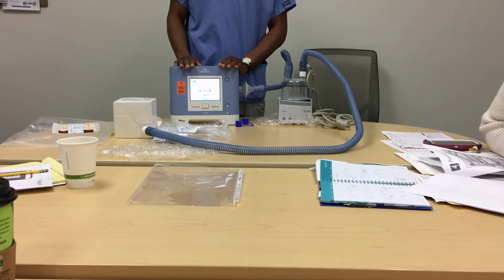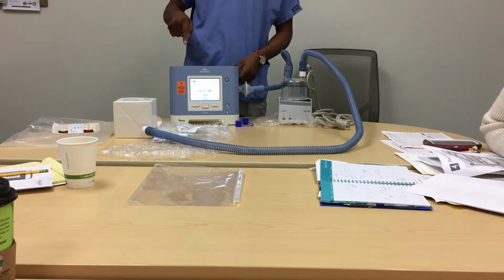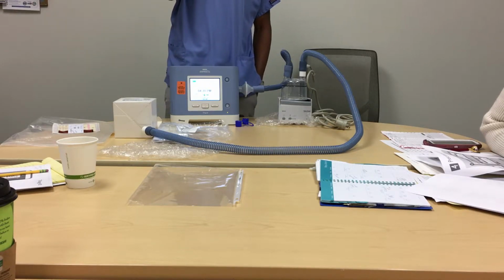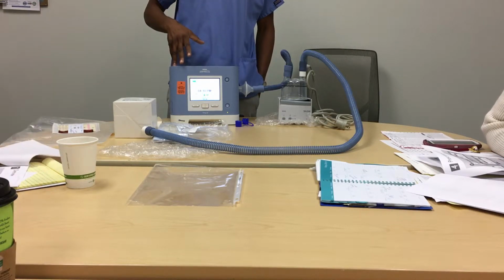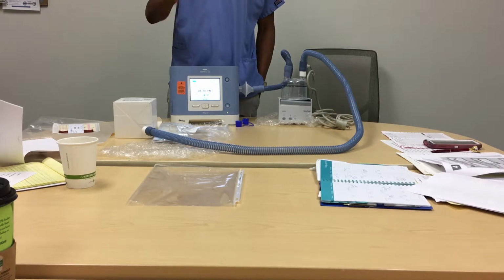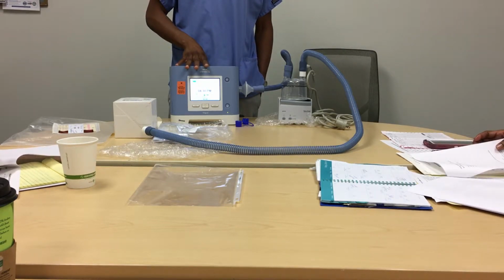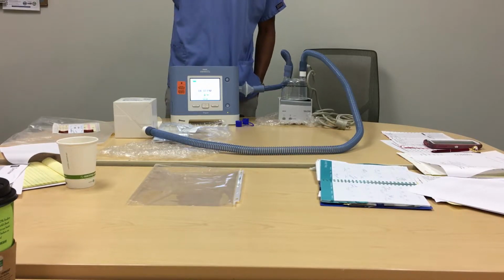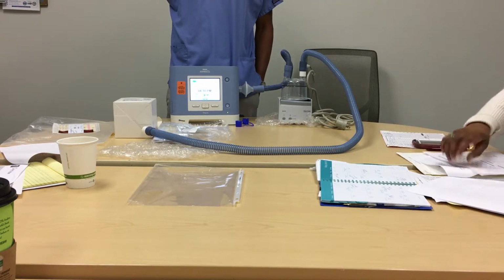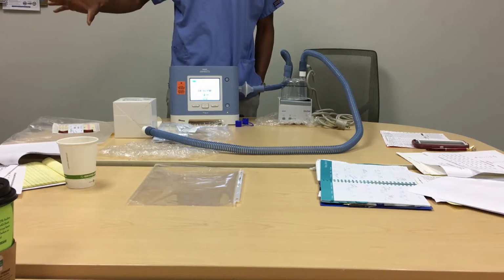So is this something that any insurance can get? Most insurances do, except for Kaisers. Philips makes the AVAPS in BiPAPs. It works closely the same, just that you cannot readily change the modes; in fact, this is a full-fledged ventilator. The AVAPS BiPAPs just strictly do the AVAPS mode. You could change it to an ST, or to just a spontaneous mode, but that's all you could do on the BiPAPs.